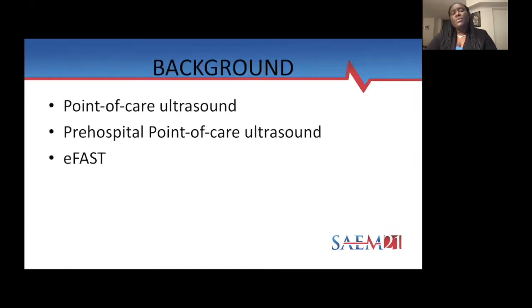The use of point-of-care ultrasound often makes diagnosing medical problems and performing procedures faster, safer, and more cost-effective. Over the years, the interest in point-of-care ultrasound continues to grow, mainly because of how it can be integrated in a physician's decision-making process, and it is a growing tool in the pre-hospital setting.